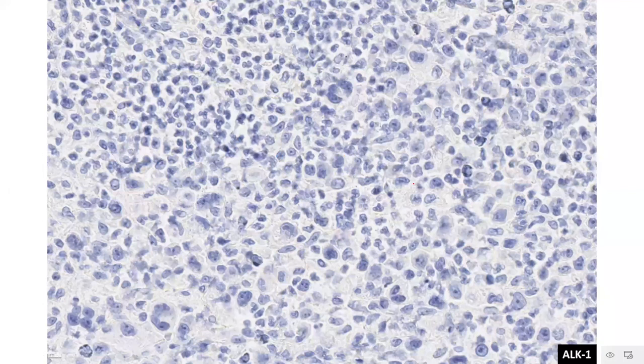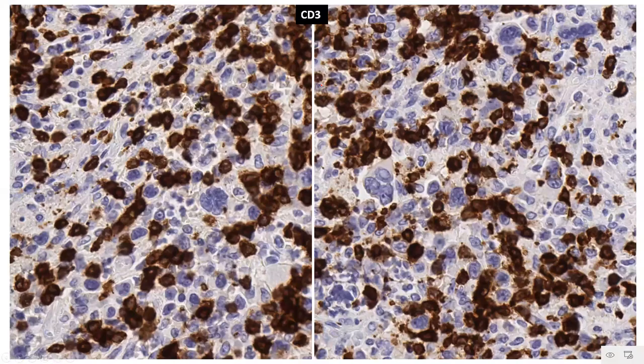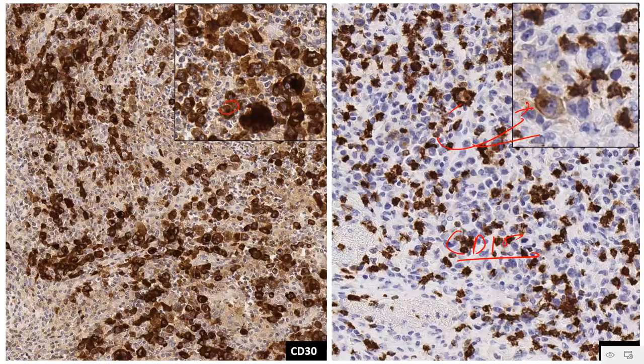Okay, ALK1, why did we do ALK1? Because of course, with such a highly anaplastic morphology, an anaplastic large cell lymphoma definitely needs to be excluded. So ALK1 is negative in these cases. However, that does not exclude the possibility of it being an ALK-negative anaplastic large cell lymphoma. But of course, ALK-negative anaplastic large cell lymphoma would not express the CD15 like we saw in this case.